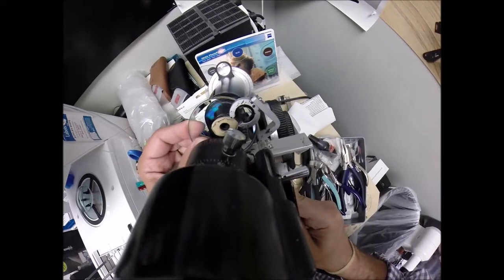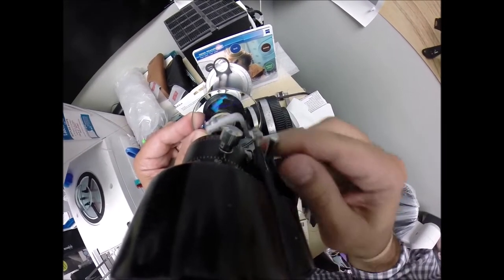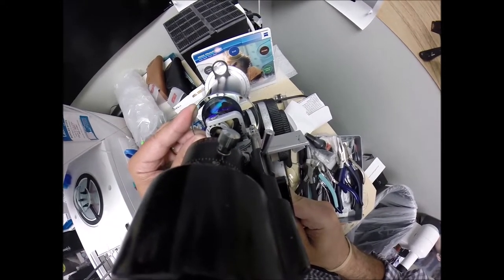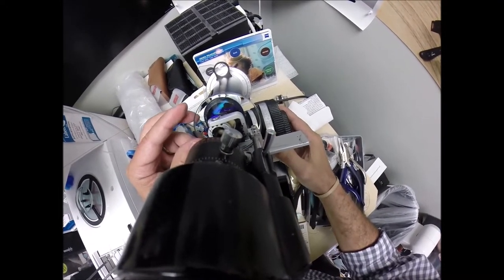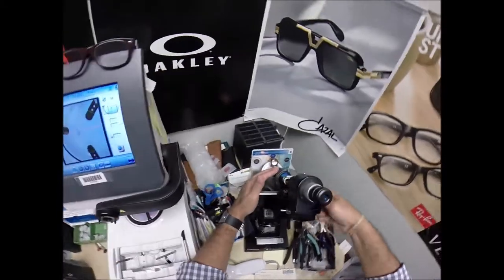And still on minus 6, put the lens in. Where's, there we go. There's the center of the lens. Come here, little center. You know you want to be a good center. Come here, center. Sorry, I just got a new pet at home. All right, check the astigmatism correction. Minus 6, minus 50, we're good to go.